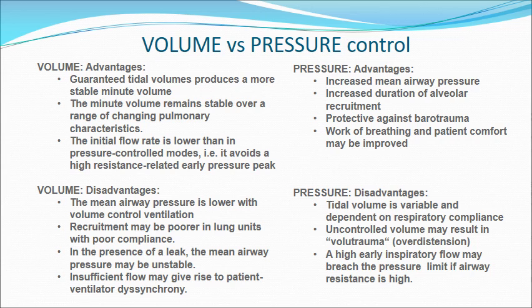What that means is if you're trying to force a flow, what happens if there's some kind of blockage in the lungs? Well, if the ventilator is trying to force a flow, that can be more damaging than if all you're doing is applying a fixed pressure. And the work of breathing and patient comfort may also be improved with pressure. Now, I've talked to respiratory therapists that say, oh, pressure is the only thing they use now. I'm sure that is not a universal case, but I think there is a migration from traditional volume control to pressure control.